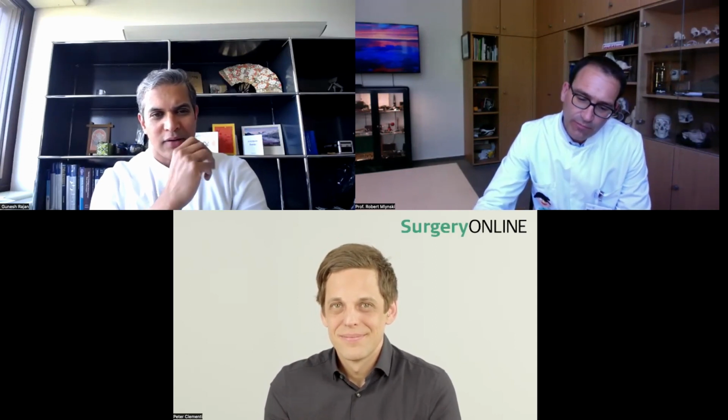That's important. Sometimes we do a lot of stapes surgery, almost all our stapes surgery, in local. And we also have a little propofol infusion running, so the patient has no pain. No pain, yeah. I only have experience with a handful of cochlear implantations under local, and it was nothing special. Obviously, you have to pay attention to the infiltration, and then it goes fine. That's why a good local infiltration, even in TIVA or general anesthesia, is important.